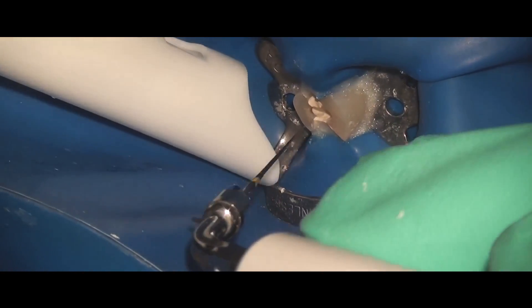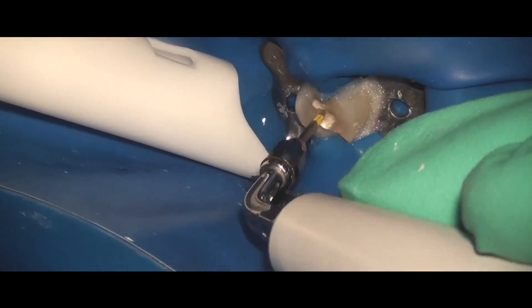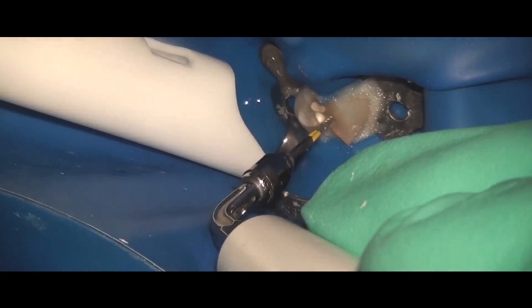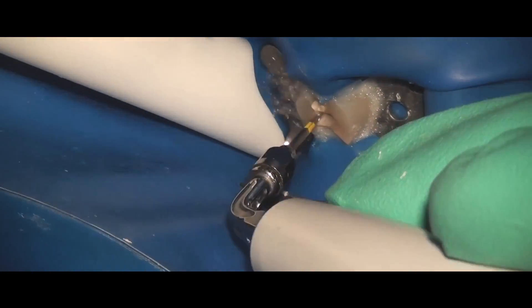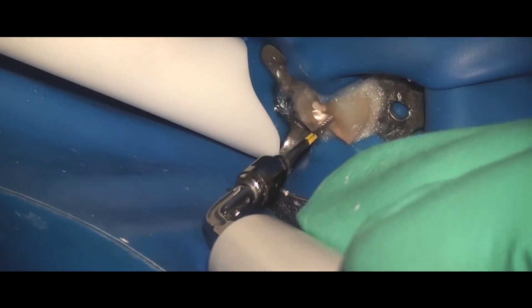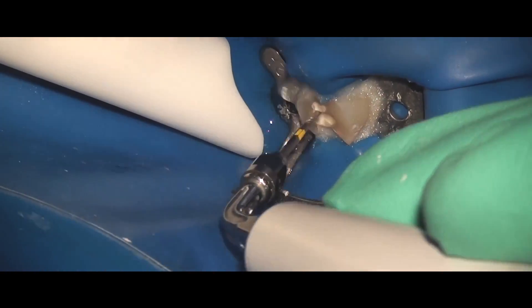I do use the E11 and E12 tips for passive ultrasonic irrigation using a size 15 U-file, taking it down to the apex or near the apex, at a very low setting so it can activate. These tips — the water actually runs through the tip and around the file — so it's a really great irrigation tip as well. But this is one more use that I didn't know about. Thank you so much for sharing this information with our viewers. You're welcome.